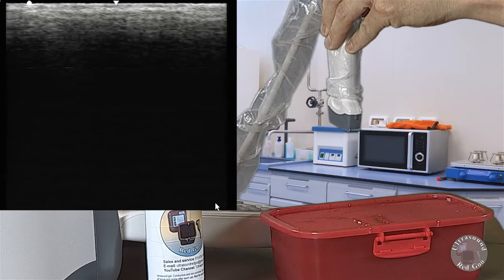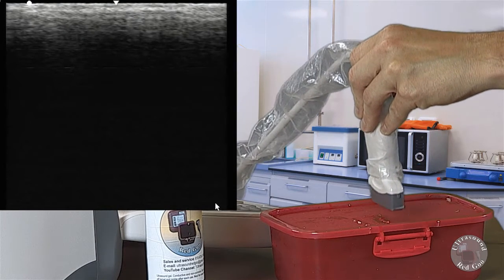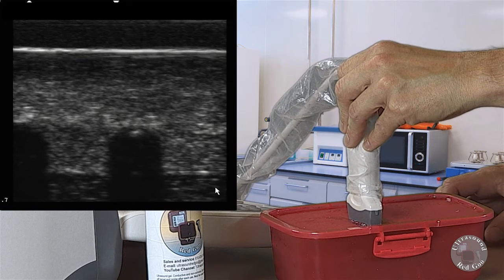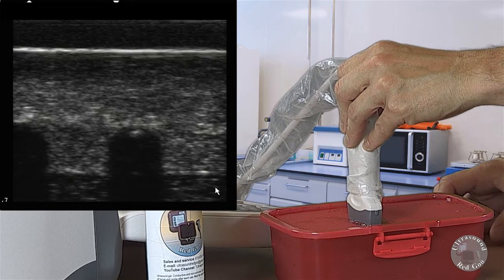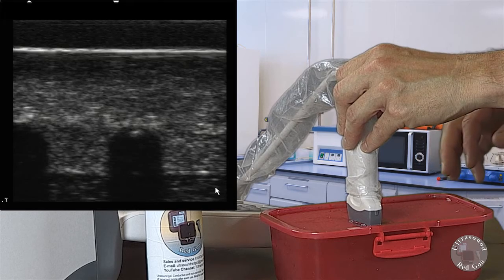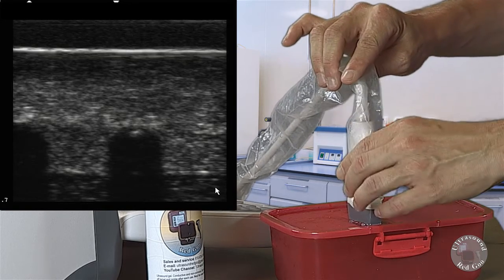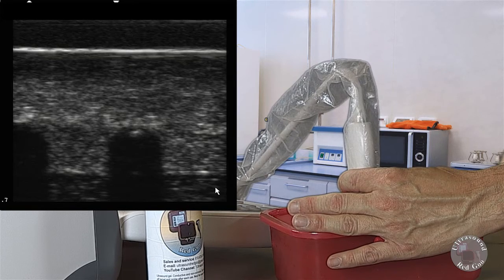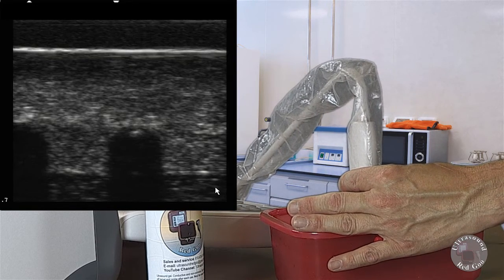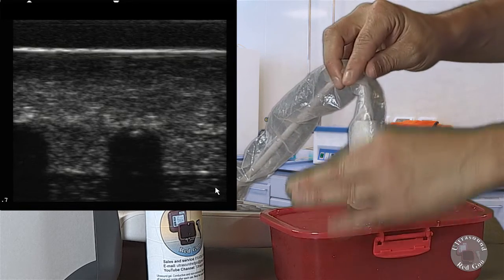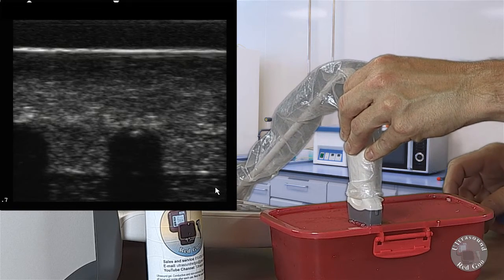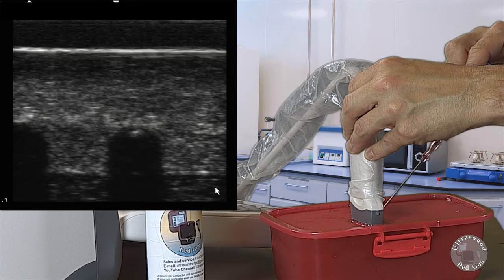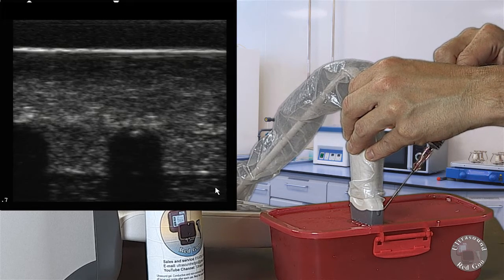Okay, great. Now that I have my probe in my non-dominant hand and I'm ready to go with my equipment, I'm going to put it down on the phantom target. Now I have my hand up high on the phantom target, but this is just for demonstration purposes. Typically while doing a procedure I have my hand resting on the sterile drape in the sterile field or near the patient, just for more stability. I'm going to take my probe with my left hand and my needle with the right, and I'm going to puncture through the skin after I find my vascular target on the phantom.